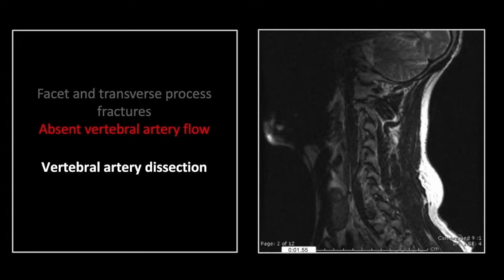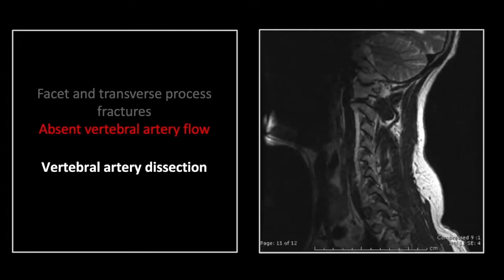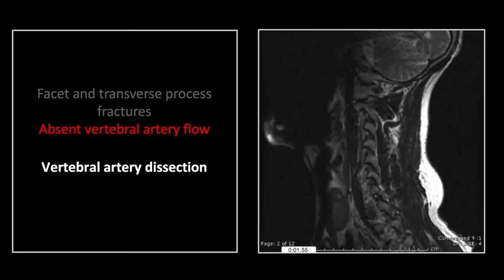On this patient's associated MR, note that the hyperintense, dissected, and thrombosed vertebral artery can be appreciated almost throughout its extent on the sagittal view. Comparing to the normal opposite side, you can appreciate the flow void within the vertebral artery there.